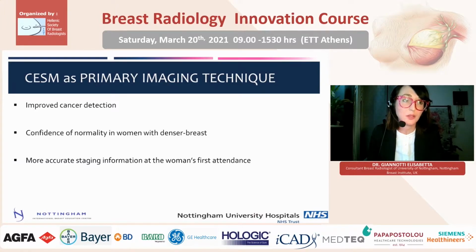It requires a little bit more time, but mainly in the time of consent and cannulating. But I think you gain this time in terms of ultrasound, because then you have your MRI, you have your contrast mammography, the recombined picture, and you know what you're looking at on your ultrasound. And I think that may also reduce false positives from whole breast ultrasound.